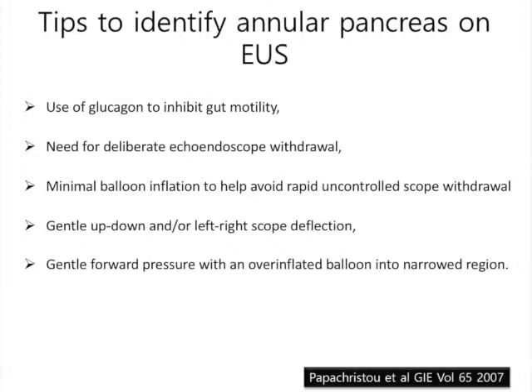the echoendoscope has to be withdrawn deliberately. The balloon should be inflated minimally to avoid rapid uncontrolled scope withdrawal. Gentle up-down and left-right scope deflection may be required for complete examination.